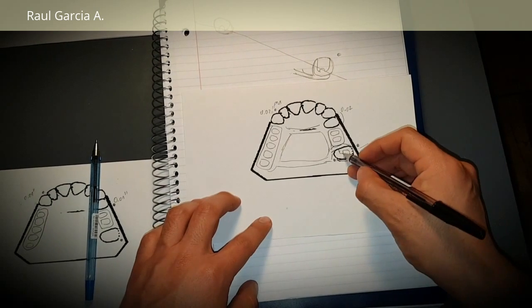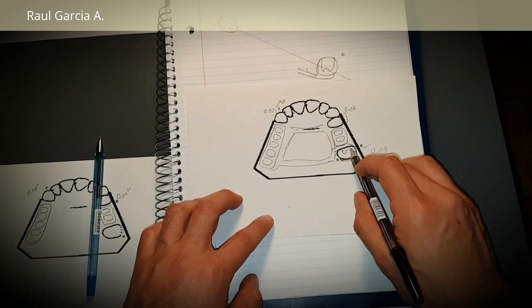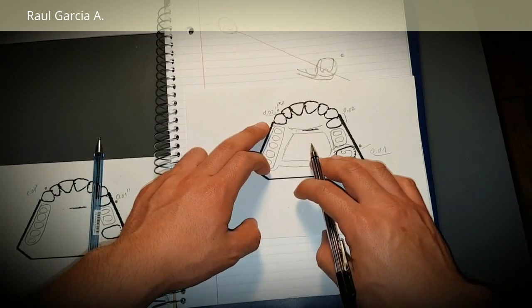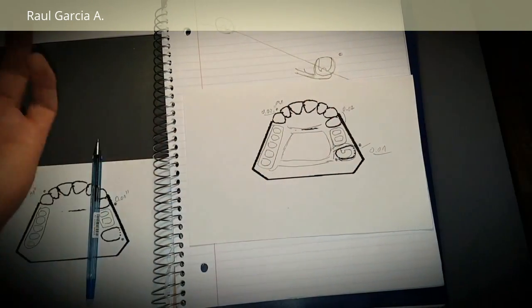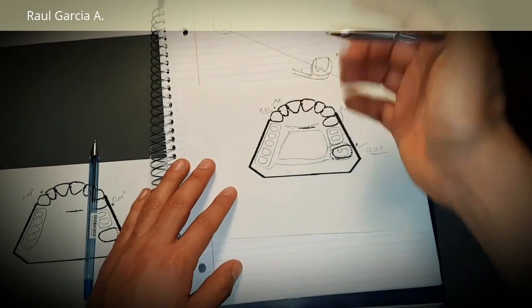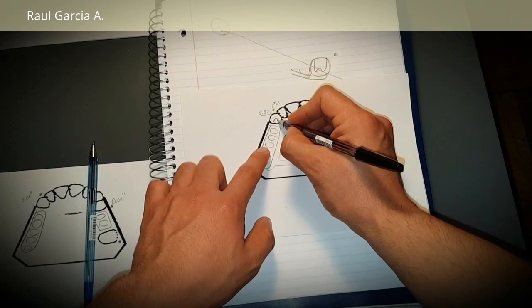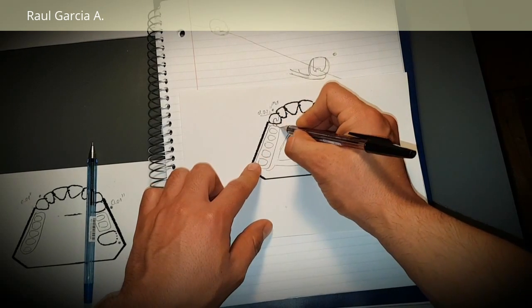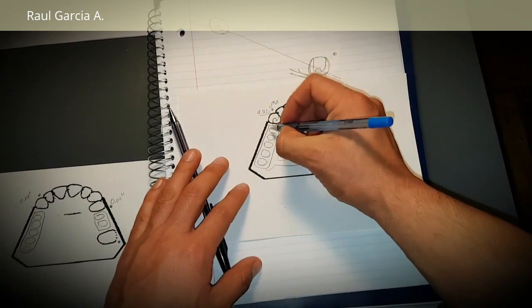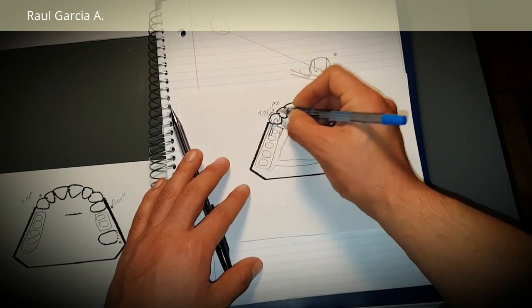Perfect. Now, you notice that we're always putting a mesial rest. So what happens if, okay, let's go here. Here then we have a 0.02 undercut. Again, we need a clasp with a 0.02 undercut in the mesial buccal. Oh, perfect. So we can use what? A combination clasp because of the undercut. It's a saddle area, you already know your four choices. So how do we design it? We already know we have an occlusal rest, a reciprocal arm as your guiding plane goes there, follows the structure, and from the saddle, from the meshwork, comes the arm, the retentive arm, which is wrought wire.